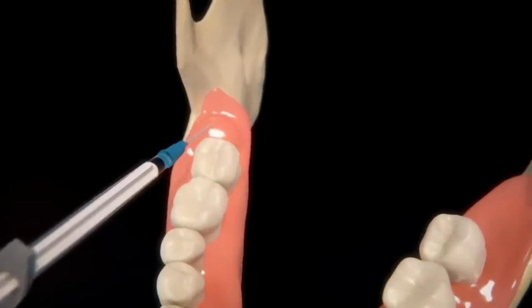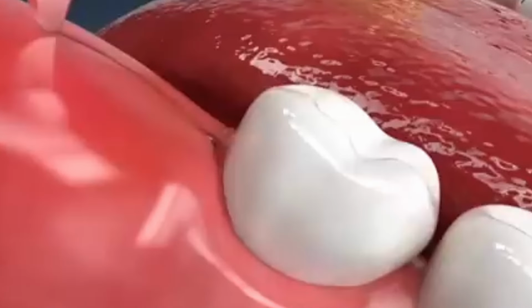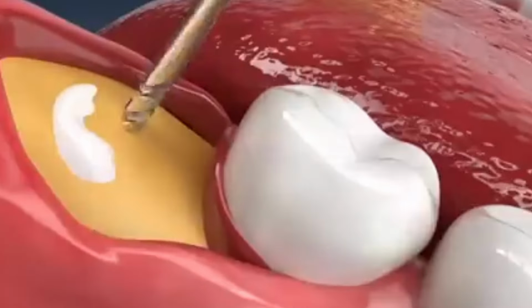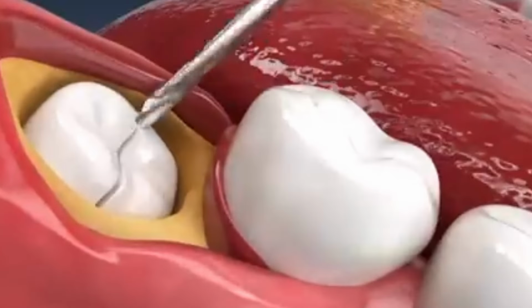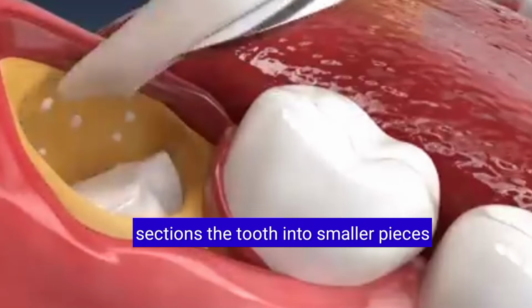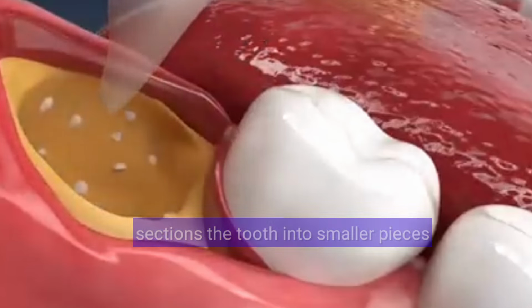To remove an impacted wisdom tooth, the dentist first numbs the area and then makes a small incision to reach the tooth. Using specialized tools, the dentist carefully sections the tooth into smaller pieces, making it easier to extract each part with minimal impact on surrounding tissue.